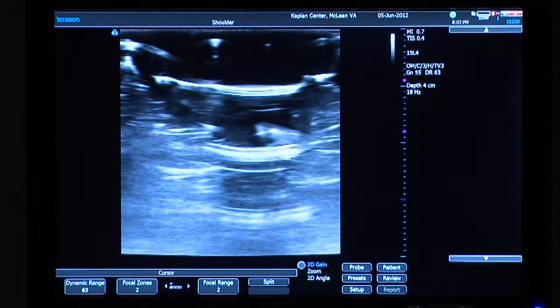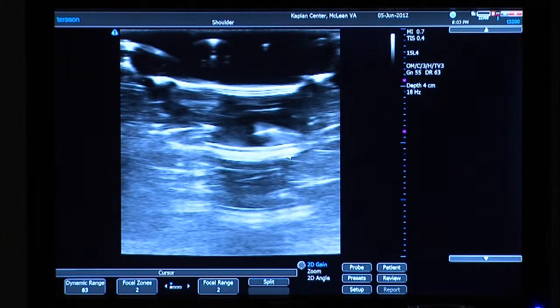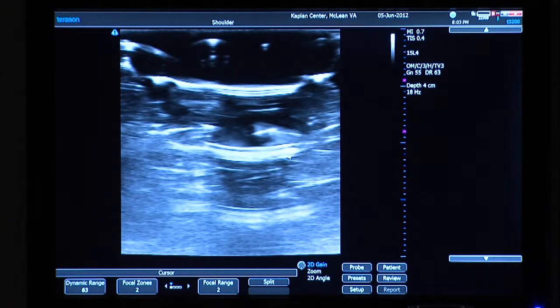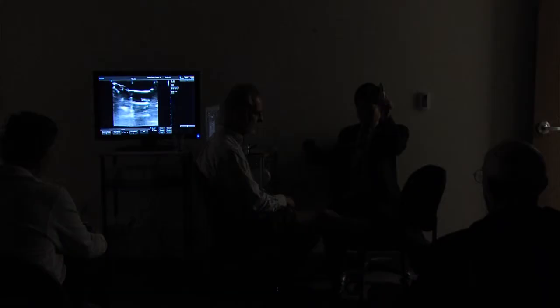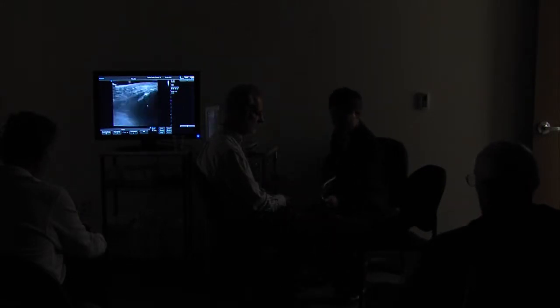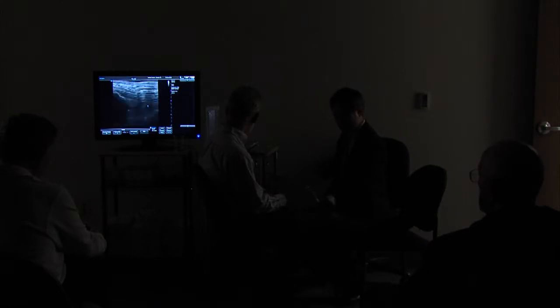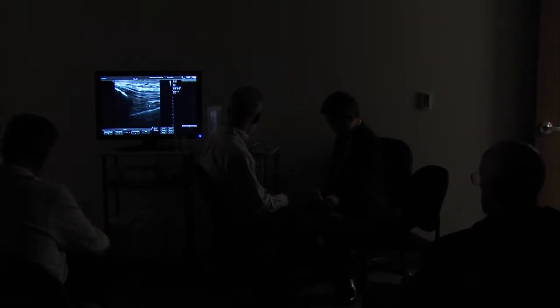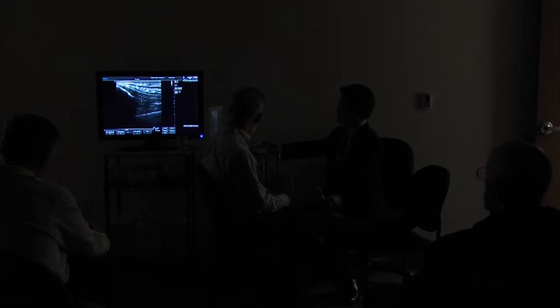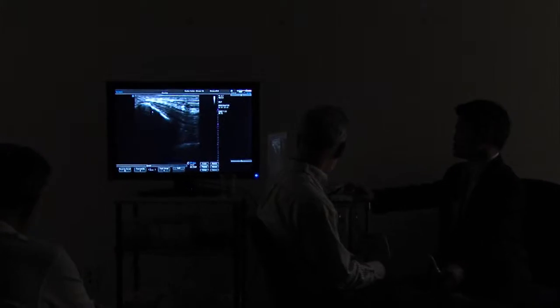Jonas here has been kind enough to volunteer his knee. He's having pain on the inside part of his knee, but because I like to be complete I'm going to start at the top. Some cold gel here. The screen looks like a bunch of who-knows-what, so I'm going to orient everybody once I get established. Hopefully you can see the little arrow — bone has a bright white surface to it.